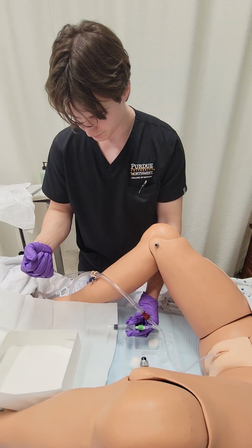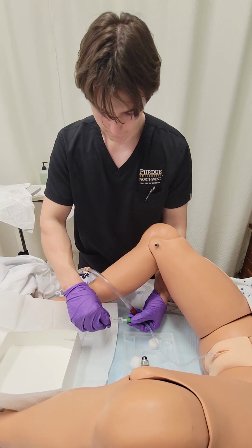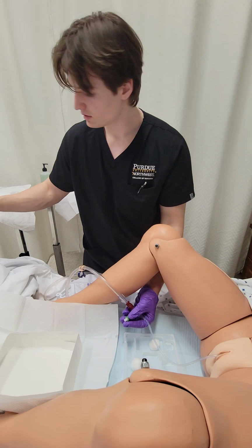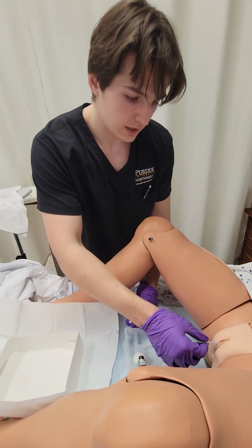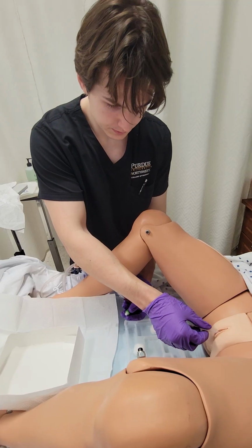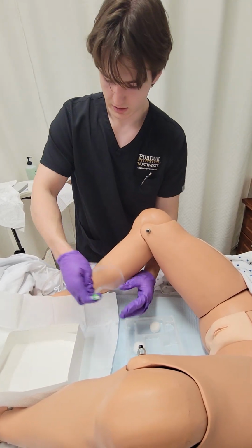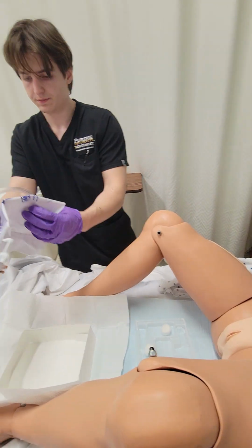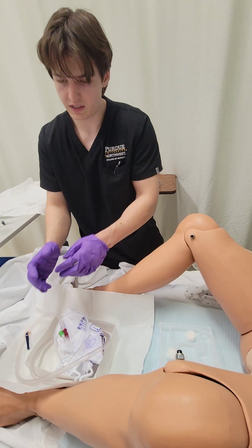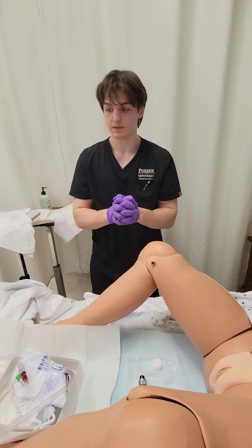Almost there. Alright, it stopped. Okay. Take that there. Set this off to the side. Alright. Just go ahead, bear down. I'm going to be removing the catheter now. I'll try and hold it up close so urine's not flinging around everywhere. So now, I'll set that just in there for the time being. So that concludes the removal and the insertion.